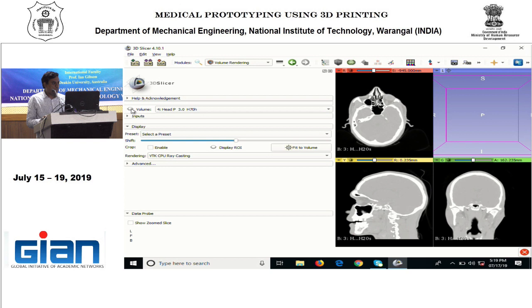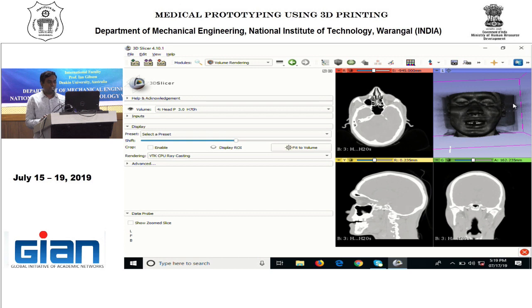Okay, I am just clicking here on volume, you can see. Next I am clicking here. This is the patient data. This is the virtual 3-dimensional model. This is the 2D. Here soft tissue is also there. Here everything is taking the CT. You have to adjust the threshold values, whatever Krishna sir is telling. Here we have to adjust the threshold. In the CT scan, Hounsfield units are the same as in the software, which is taking the threshold values.